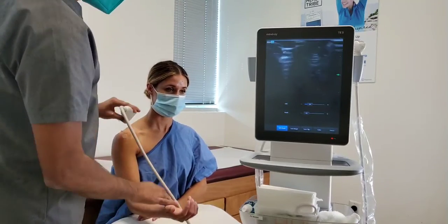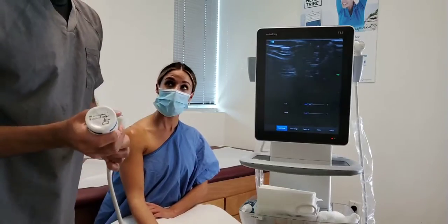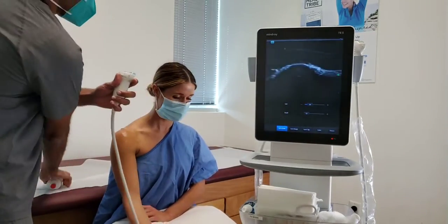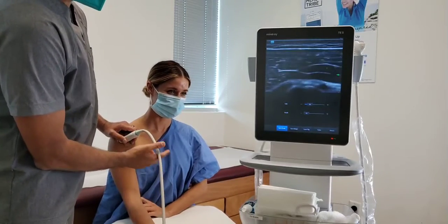Sliding off a little. Oh, I'm going to grab some more gel. Hope you guys can see this. I can't see the screen, so I'm only assuming that you can see this really well. I'd say to let me know, but I can't see the screen to know if you're commenting or not.